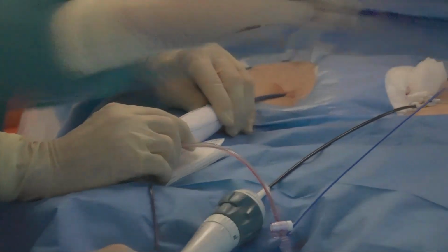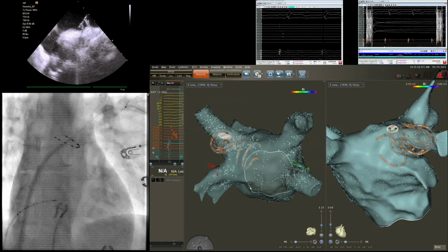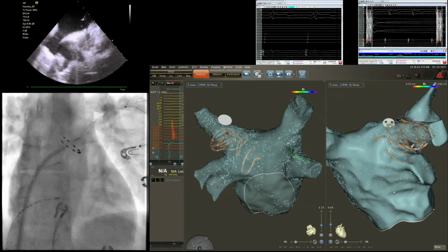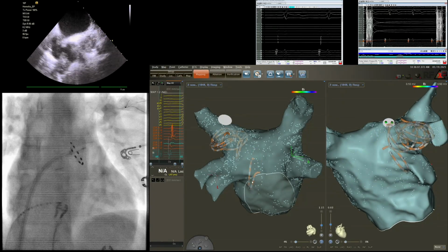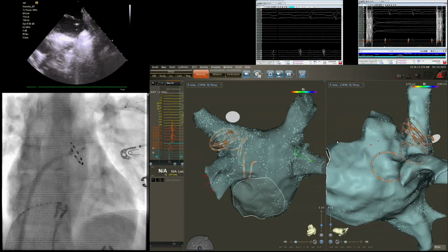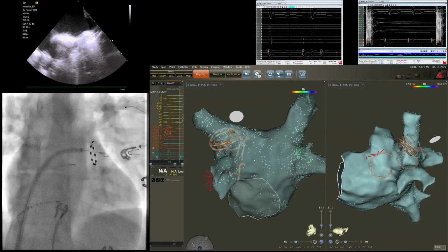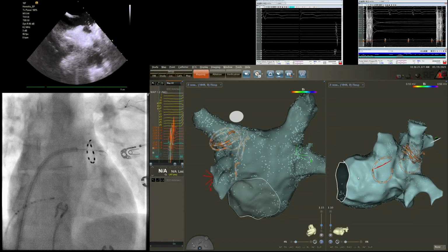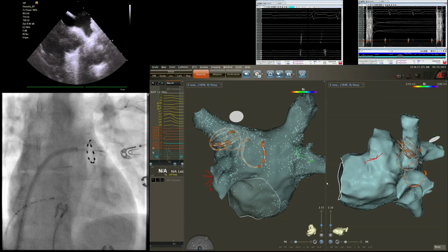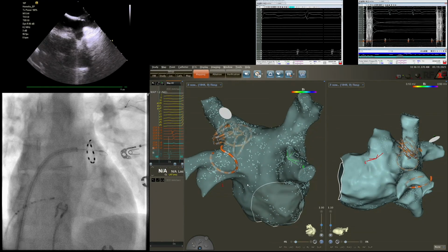Okay, so now let's try to get, okay, perfect. I'm going down. Okay, perfect. Go with the wire. Let's target. Okay, perfect. Okay, it's going there. Should be more posterior. Okay. Deflecting now, coming. Is that on the vein? Yes. Okay, perfect.